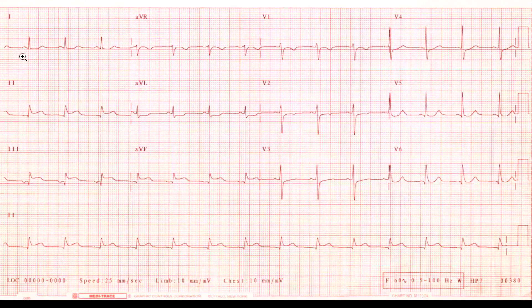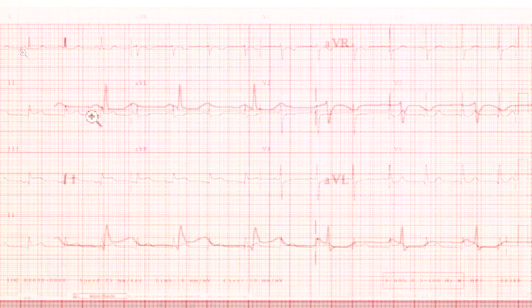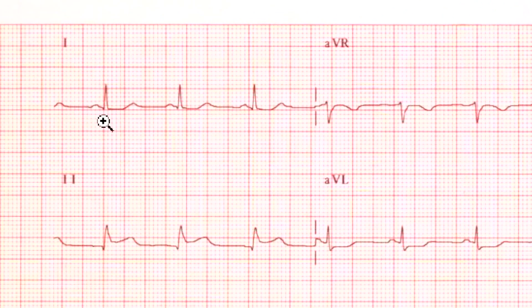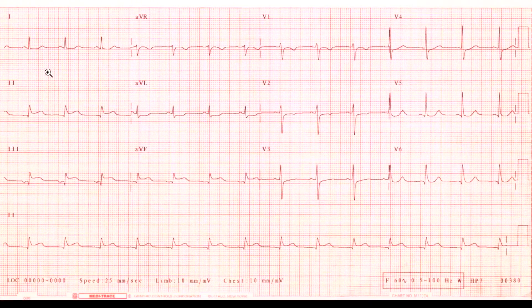For those who are not facile with ECG interpretation, the first little bump is called the P wave, then this spike is called the QRS, and then followed by the T wave.